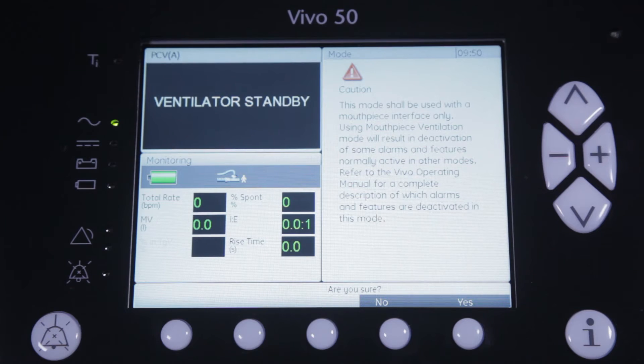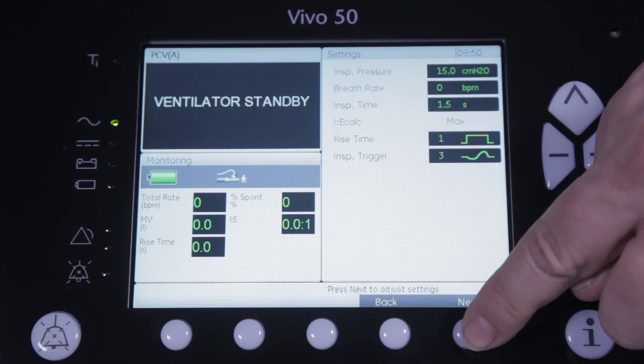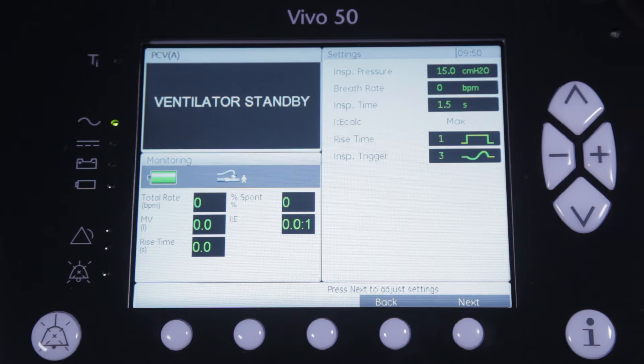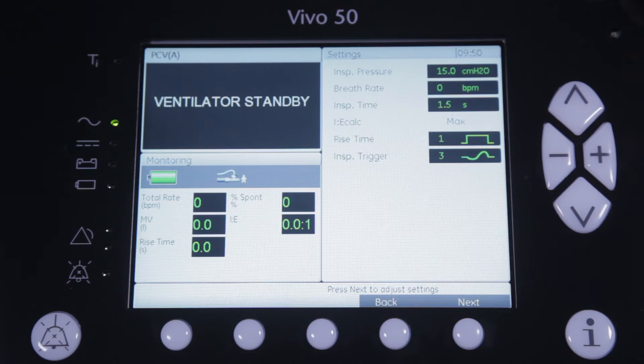Once you've acknowledged this message by pressing yes, you will see all the settings that are applicable for pressure controlled MPV. The number of settings have been reduced and optimized for MPV, which allows you to set mouthpiece ventilation in a quick and easy way.